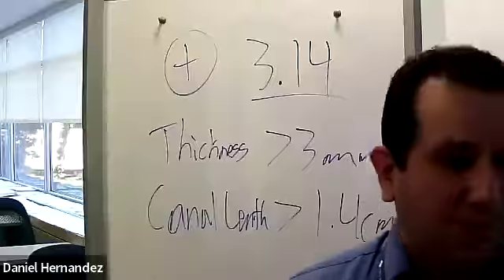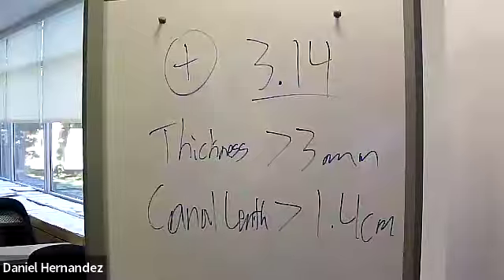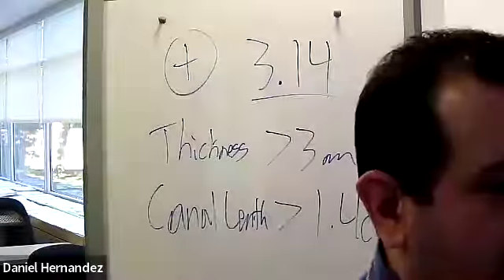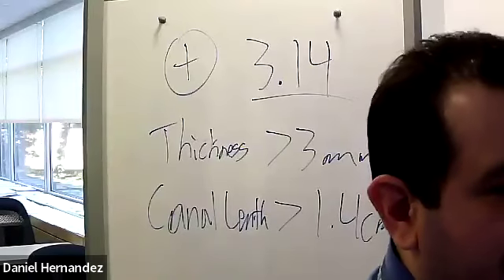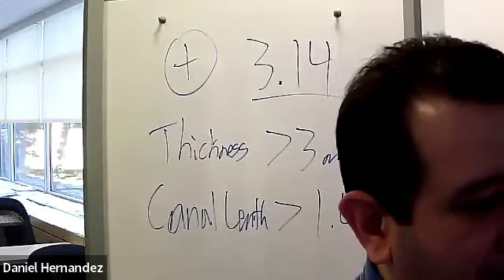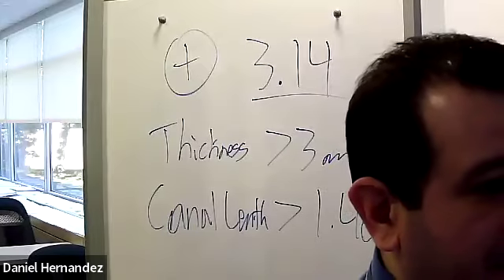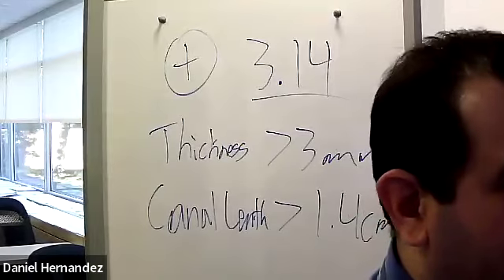So these were just some normal pylori studies. Again, when it's positive, it becomes heavy, so it can be displaced posteriorly, making that length a little bit harder to image. Here was a transverse, so turning transverse on that, you could see the thickening of that channel.